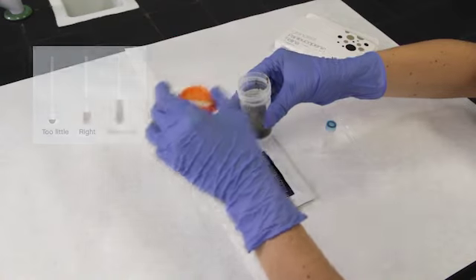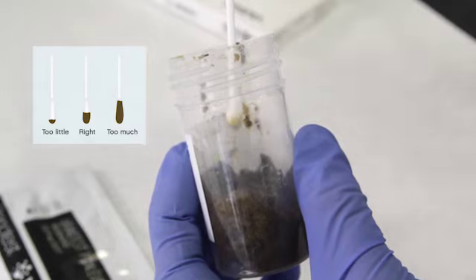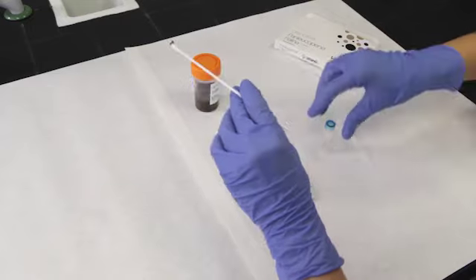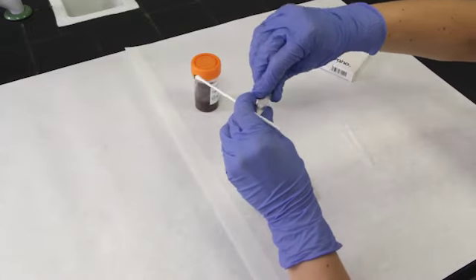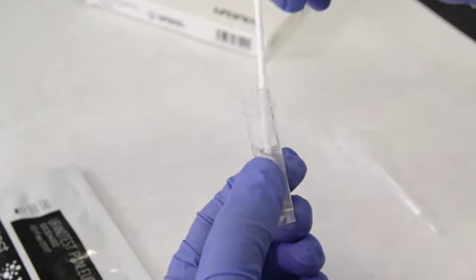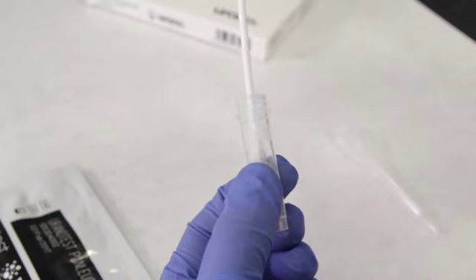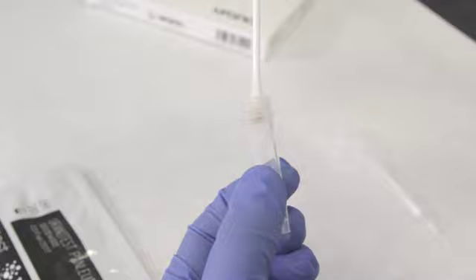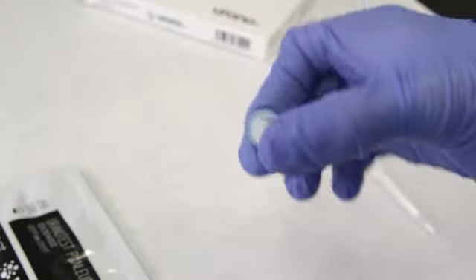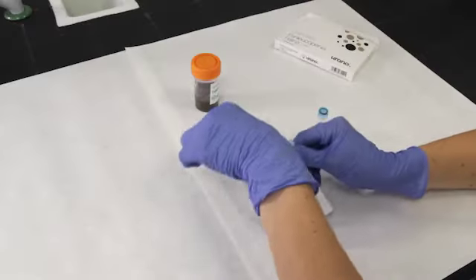It is important to take the right amount of feces, trying not to take too much or too little. Insert the swab, impregnated with the sample, in the tube of diluent and mix well for 10 seconds. If there are thick materials in the sample, wait for a minute until they settle. Otherwise, the sample can be taken from the mixture prepared previously.